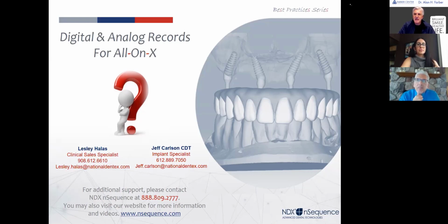A lot of us here in this group have machines, and we can talk another time about who likes what machine. Thank you for that. And the other thing too is, if you get a new machine, Dr. Fazio, feel free to do a scan and send it to the lab and have them say, hey, how's this looking for you guys? What do you think of this setting I'm at? So before you get an actual case, you could work something out. We'd be happy to do that for you.